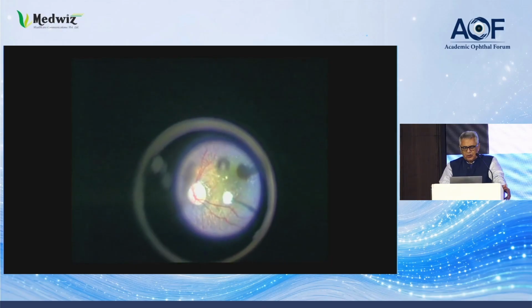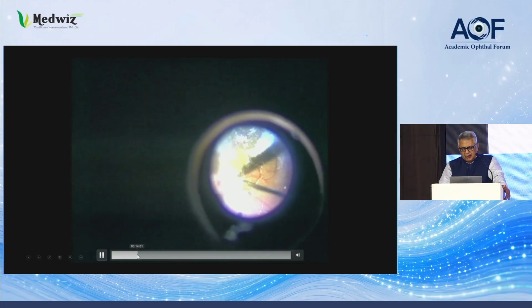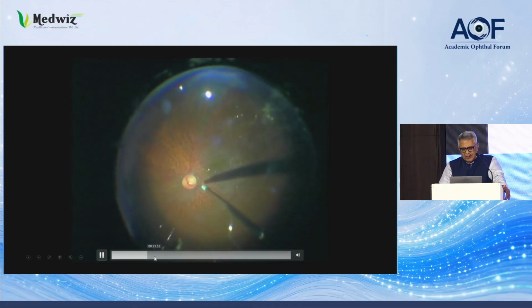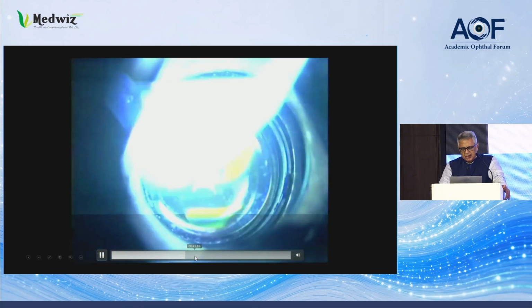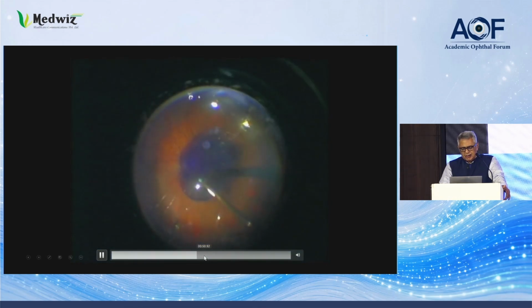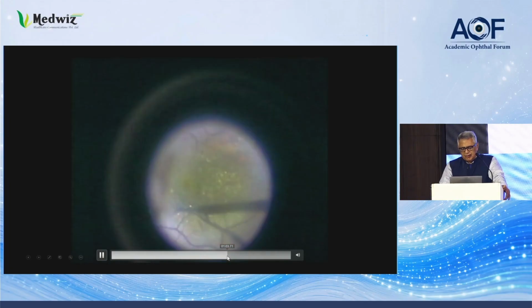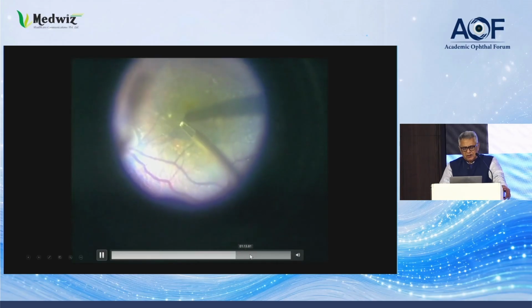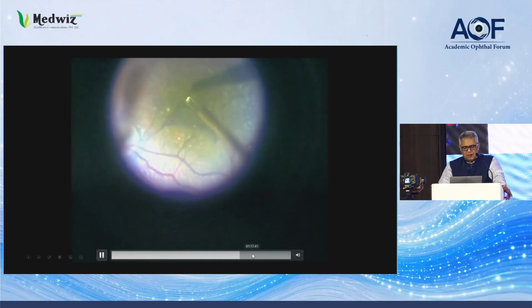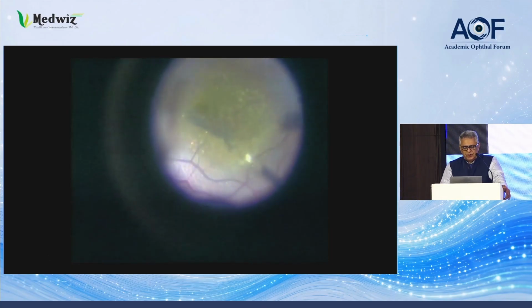There's another patient who has ARMD, dry ARMD plus, has a significant ERM. So after you have detached the hyaloid with the help of triamcinolone, you inject a few drops of trypan blue on the posterior pole after the air-fluid exchange, and you wash away the excess trypan blue, and with the help of an MVR blade, try to create an edge. Once this edge is created, then take hold of Eckardt forceps, and this epiretinal membrane will generally come in one go. And after that, you do an air-fluid exchange.